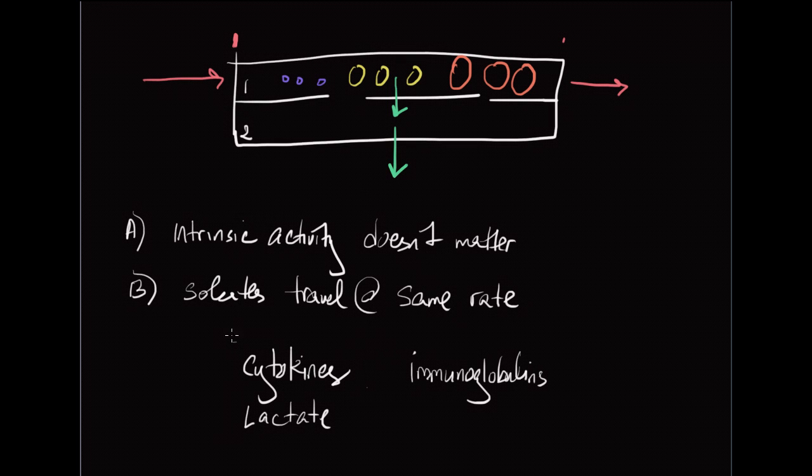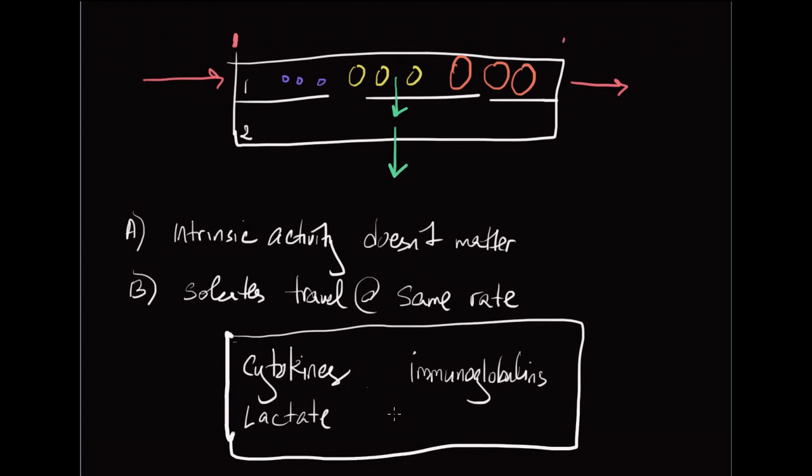So in general, you can try to eliminate larger molecules. Sometimes you have middle molecular weight uremic toxins. Of course, those are not yet identified, but you cannot assume that all uremic toxins are small. Some of them are middle molecular weight, and they can be removed at the same rate as those small ones if you do convection. So that's convection.